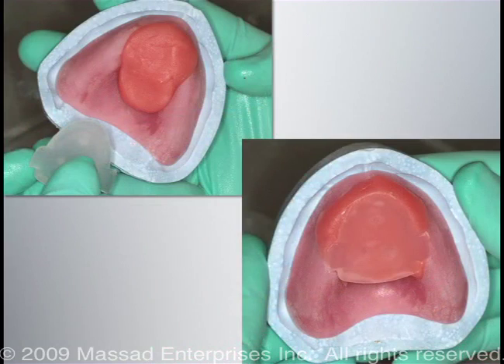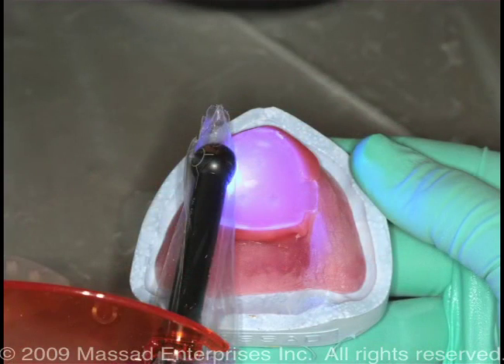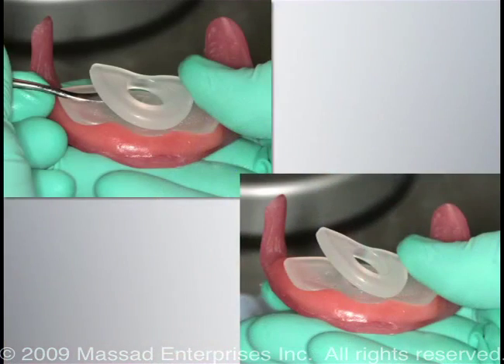Next, place light cured resin on the palate of the maxillary base plate, placing the striking plate directly into the resin. Now take both the maxillary and mandibular record bases and hold them together, allowing enough pressure to parallel the striking plate with the pen receiver. Light cure until completely polymerized. Now remove the spacer.